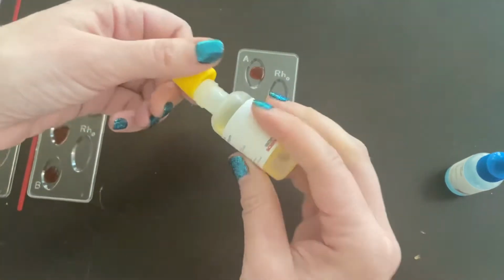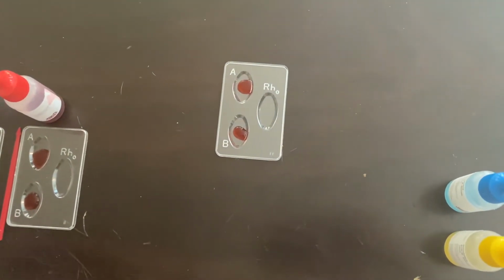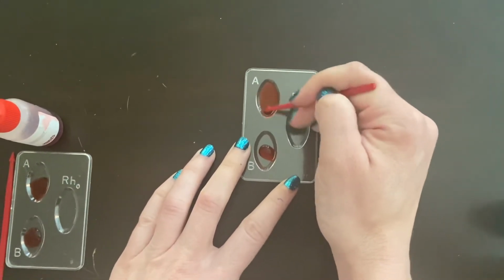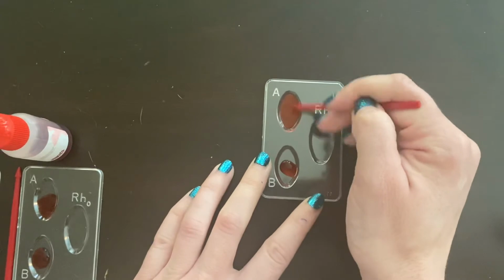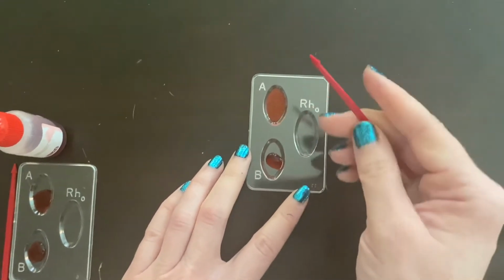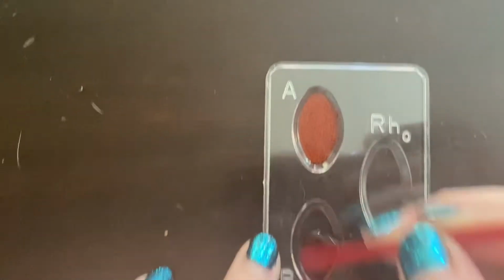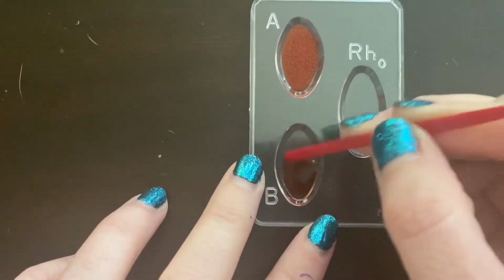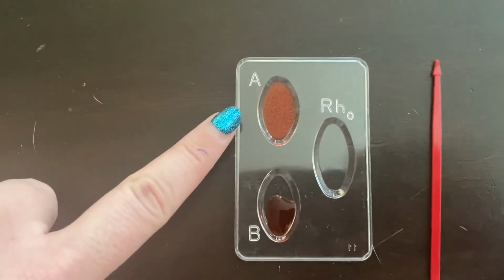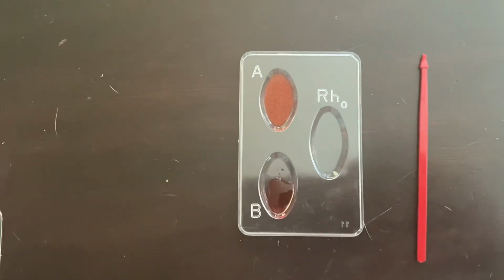This one is anti-B, so I'm putting that in the B slot. And then I'm just going to take this little tool and stir it up to see if there is going to be a reaction. Basically, if the blood sticks to the entire area and starts to bubble or change color, that would show a reaction. If it just stays the same and doesn't really do anything, there's not a reaction. So for this one, there's definitely A present, there's no B present. So we would say that this is a person with type A blood.